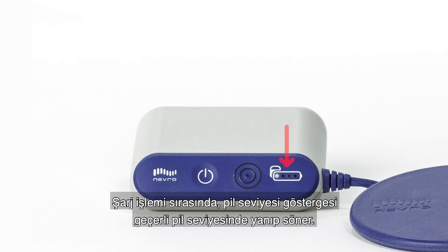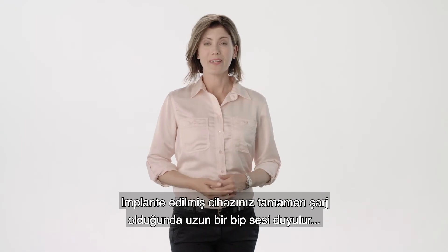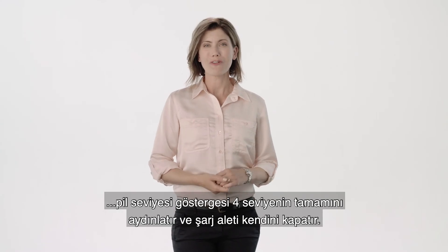During the charging session, the battery level indicator will blink at the current battery level. As charging completes, each battery level illuminates. Once your implanted device is fully charged, one long beep will sound, the battery level indicator will fully illuminate all four levels, and the charger will turn itself off.